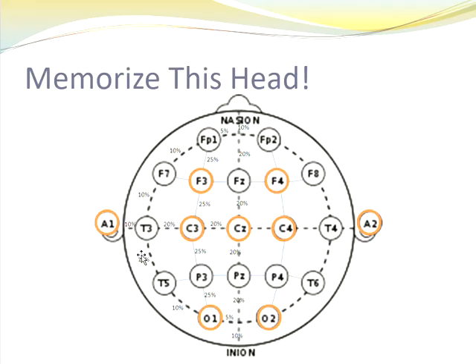So if we were to divide all of these marks into even segments, which they are, it's 10%, 10%, 10%, 10%, 10%, 10%, 10%, 10%, 10%, 10%. So if you count all these segments, there's 10 of them. So each one is 10%. You're asking, well, where did the 5% come in? Well, the 5% came in because our first mark for this was halfway. 5% one way, 5% the other, so the total distance between FP1 and FP2 is 10%.